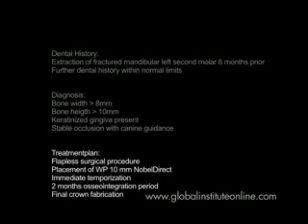The treatment plan for this patient is a flapless surgical procedure, the placement of a wide platform 10 millimeter length Noble Direct implant, an immediate temporization, then the allowance of 2 months of osseointegration period, with the subsequent final crown fabrication.